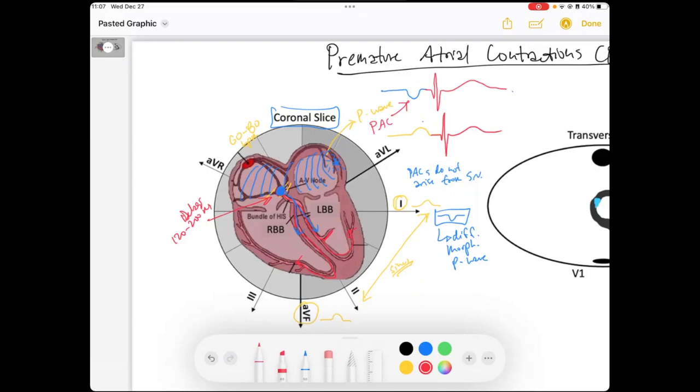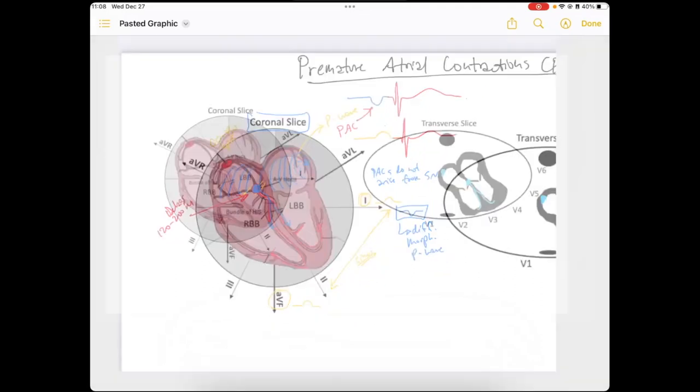And so, PACs, because of that, will classically have QRSs that look the same as the normal QRSs, but they occur early. And when you look at the P wave that drove that QRS, it's going to look a little bit different. So, let's take a look at an EKG with PACs.